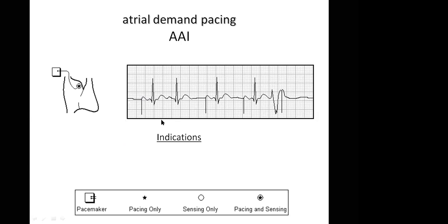It looks like a T wave, sir. Okay, so you think it is a T wave, right? So look at this. This should be what? That's a T wave, sir. Okay. This should be what? T wave, sir. Okay. So look at this very well, though. Look at the distance, the duration. Is it the same duration as this? Okay, wait. Look at the height. Is it the same height as this? No, sir. It means it's like a baby sister, sir.